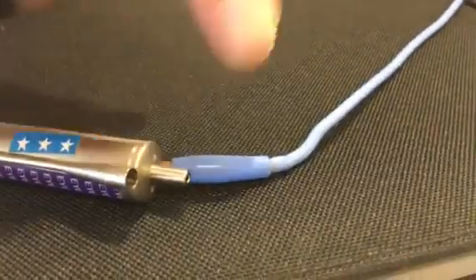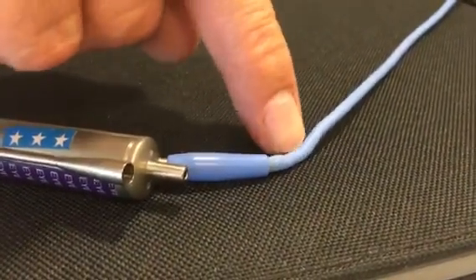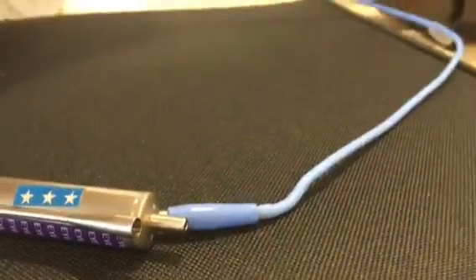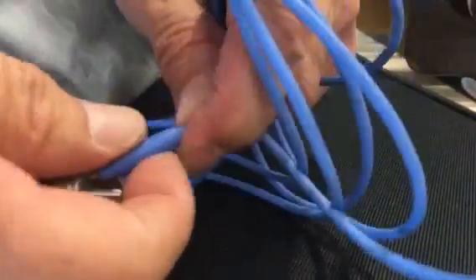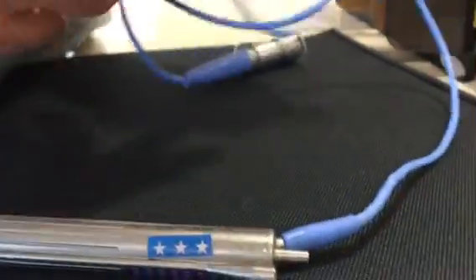And so for the most part, now, however, where it was kinky inside the hernia, it has some memory left in the wires, so that seems to sort of maintain its position even after you've milked it out of the end. But at least you don't have the big hernia developing right there, which can burst through. Okay, good. That's it.